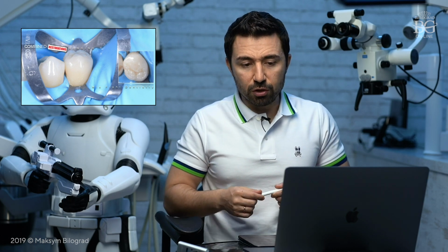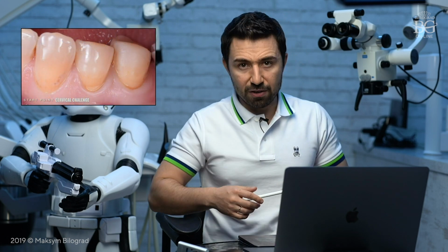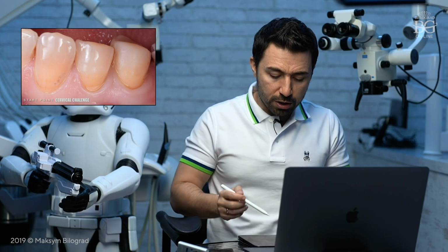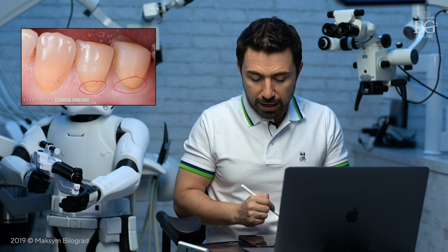So this is the final result of the crown that was bonded, and I would like to share with you another case which is pretty similar, but slightly more difficult because there is no caries defect. Here you can see abfraction, okay?